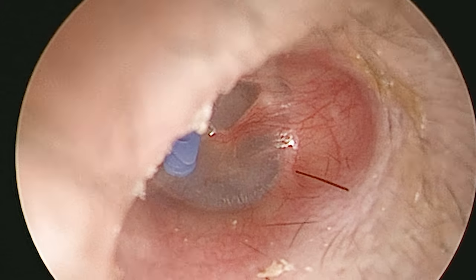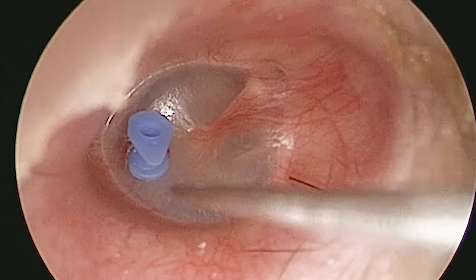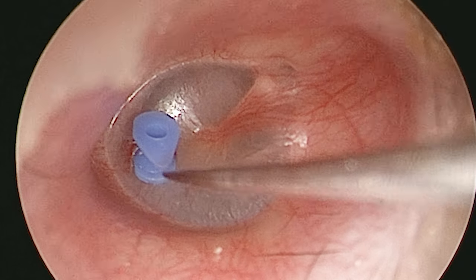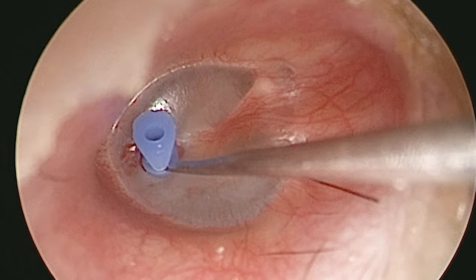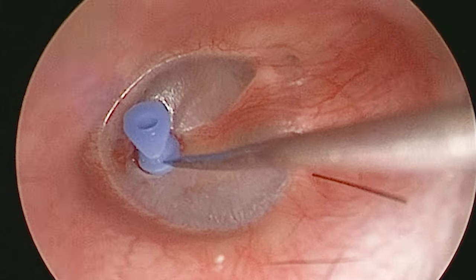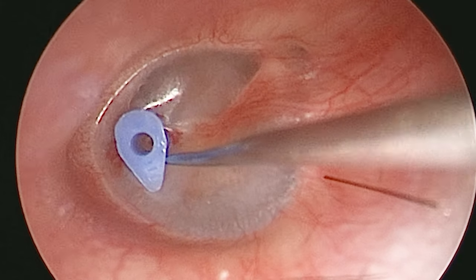What I'll do now is gently ease this grommet into place, and make sure that the hole is pointing towards me, because this helps me later in clinic if I want to know if the grommet is blocked or not. And that's it.